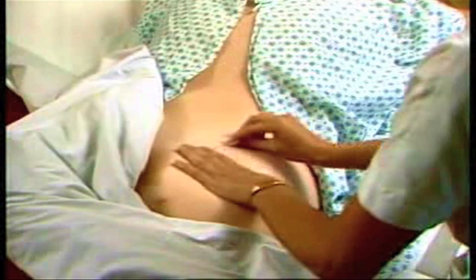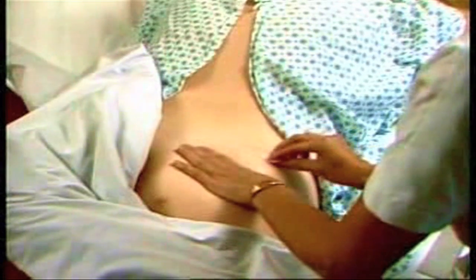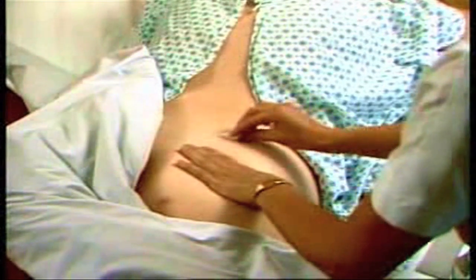The Z-track method for deep intramuscular injection may be used to administer medications that are very irritating to tissues, such as Imferon. This method helps to keep the medication in the muscle tissue and away from subcutaneous tissue. Once the injection site has been determined and prepared, be careful not to touch it. Use the ulnar side of your non-dominant hand to pull the skin laterally to displace the layers of tissue above the muscle. Insert the needle at a 90-degree angle and aspirate to determine if you have entered a blood vessel.